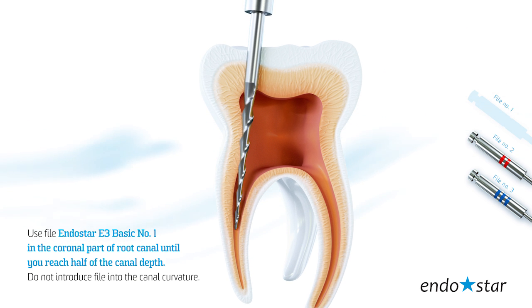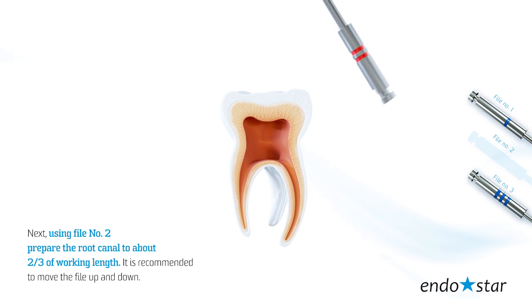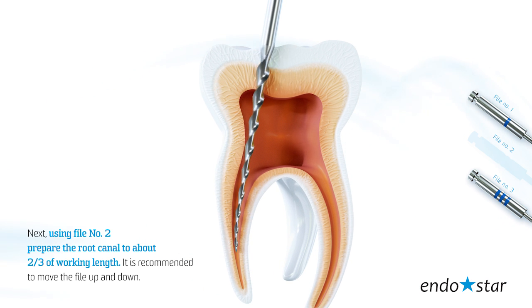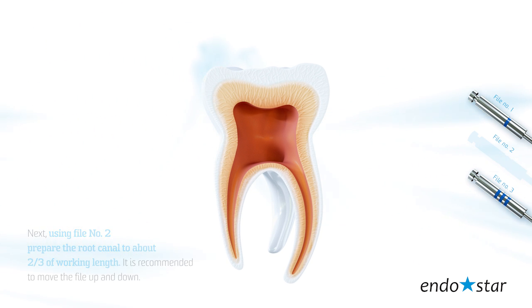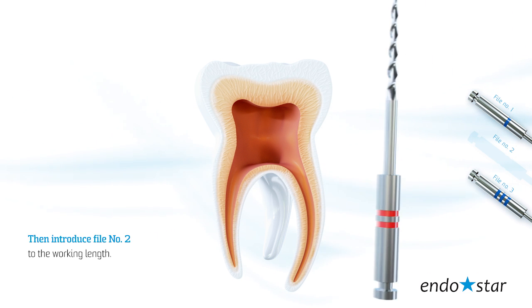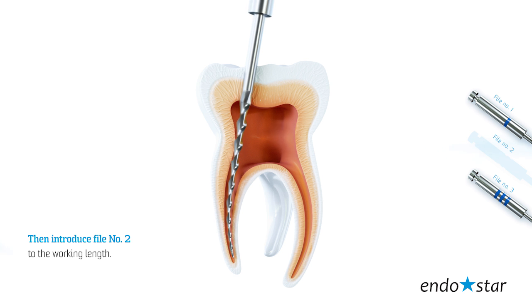Do not introduce the file into the canal curvature. Next, using file number 2, prepare the root canal to about two-thirds of the working length. It is recommended to move the file up and down. After using file number 2, rinse the canal with at least 1 ml of irrigant and verify the working length using S-files size 15 and an apex locator. Then, introduce file number 2 to the working length.